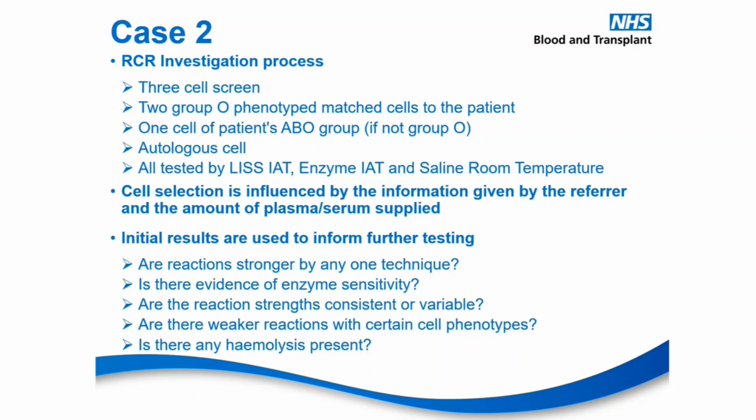The cell selection is influenced by the amount of plasma and serum supplied and by the information given by the referrer. So all these things are taken into account and the investigation is planned meticulously before any testing is started at all.